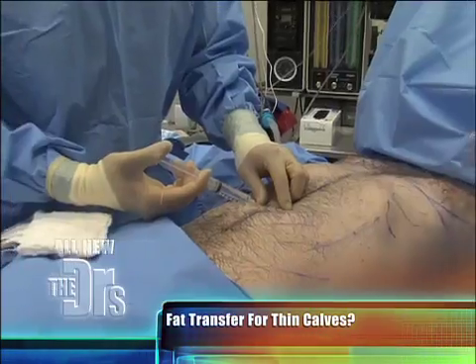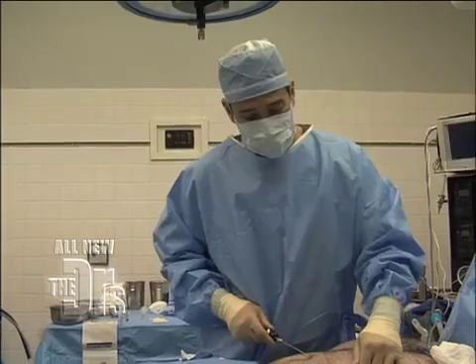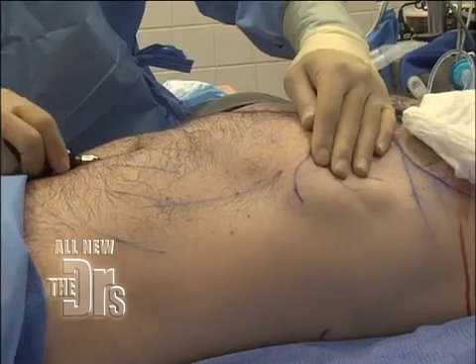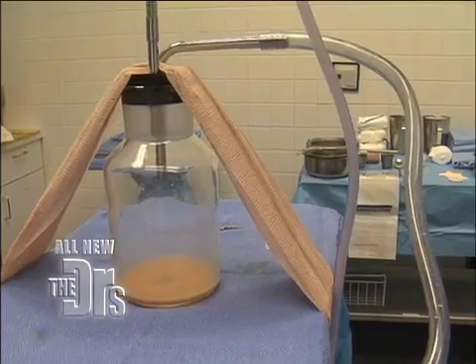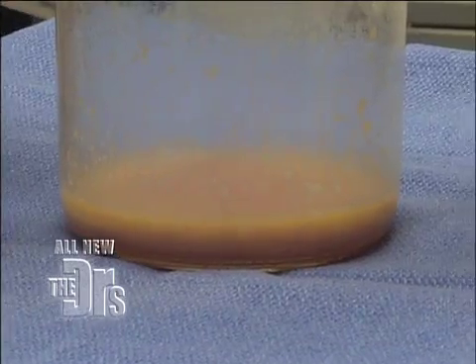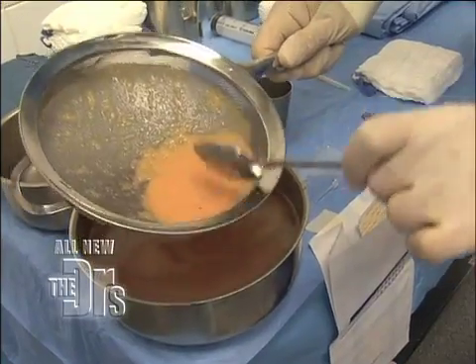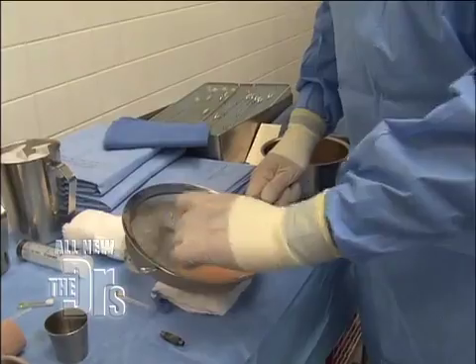We're gonna be doing all this under local anesthetic, which means we have to numb him very, very well. Now this solution is going in between the skin and the muscle, into the fat layer. The fat travels up through this tube and into this jar here. You can see the fat's starting to come out. The mix of fat and fluid is already starting to separate. So now he's gonna wash the fat — it removes blood and other things mixed in with the fat that we don't want. Rinses that out so it's pure fat.